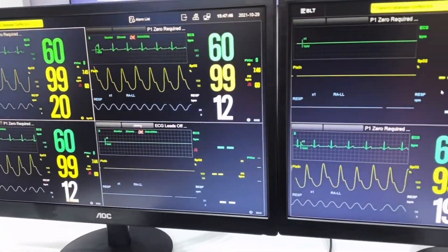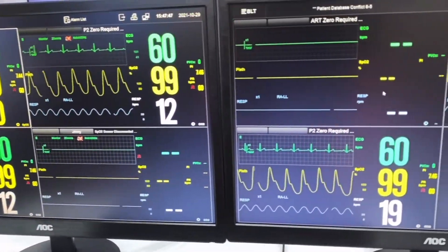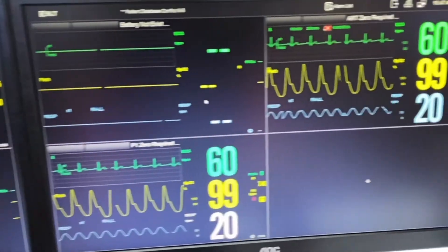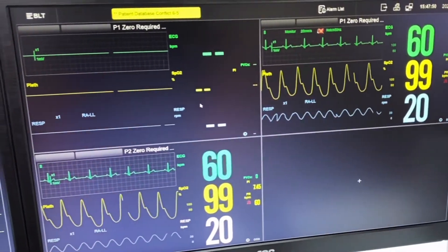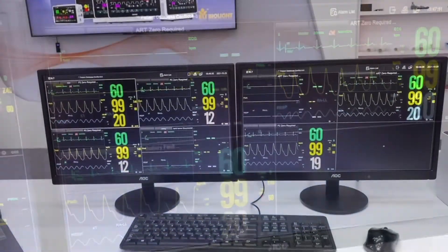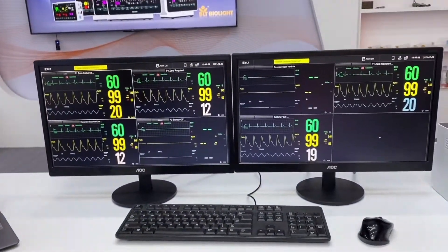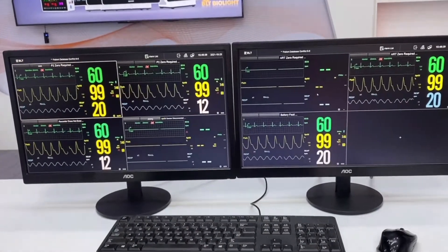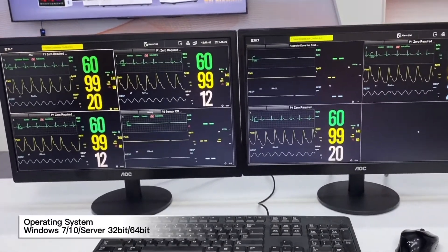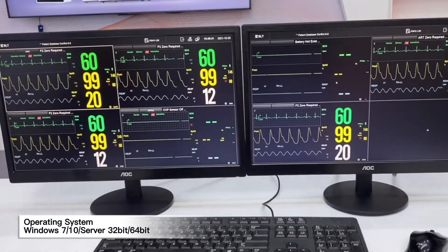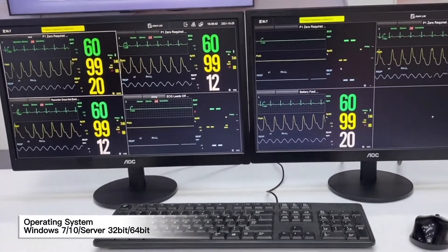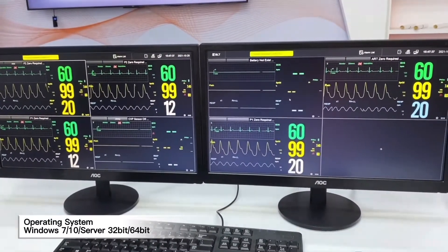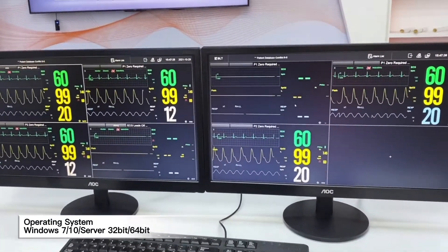Hi everyone, this is Jimmy from iOlight. Today we will be introducing our brand new CMS iO Vision. As you can see, we have already connected 7 patients in the system. The operating system is Windows 7 and Windows 10, with a server of 32-bit or 64-bit.